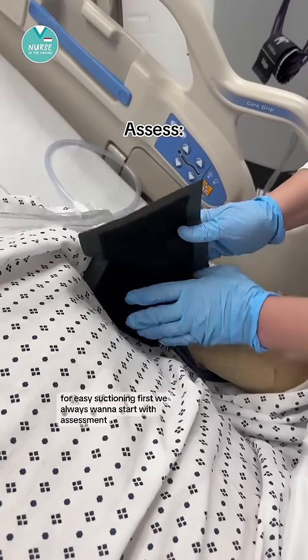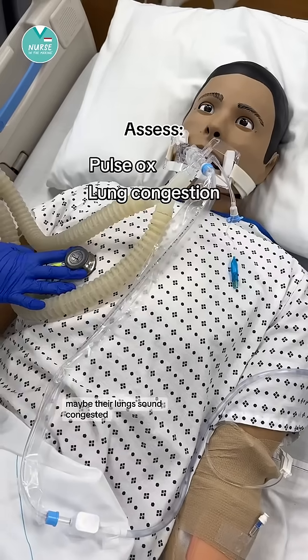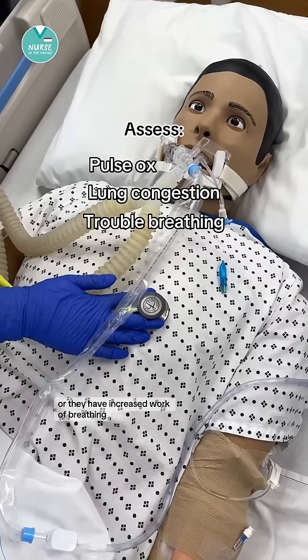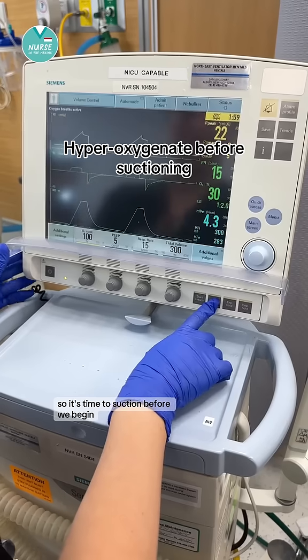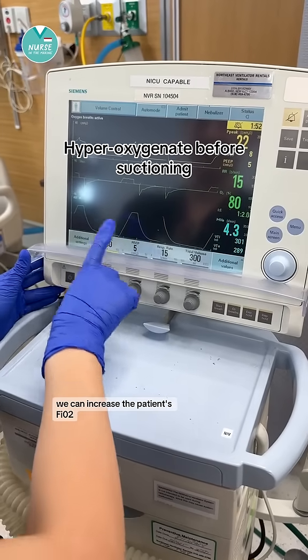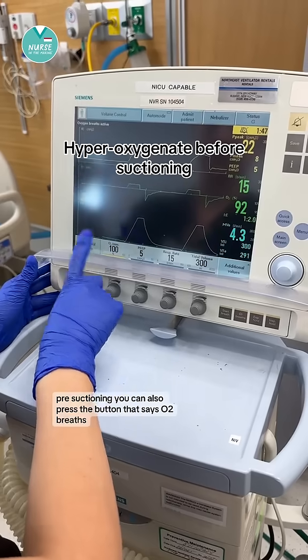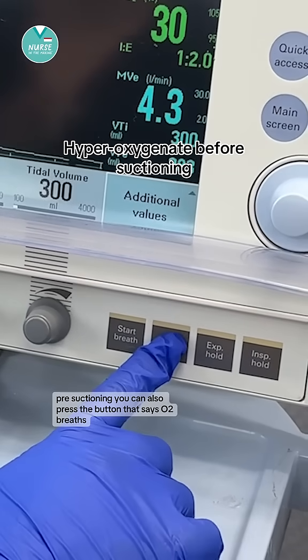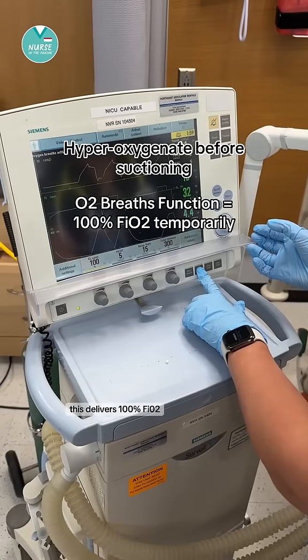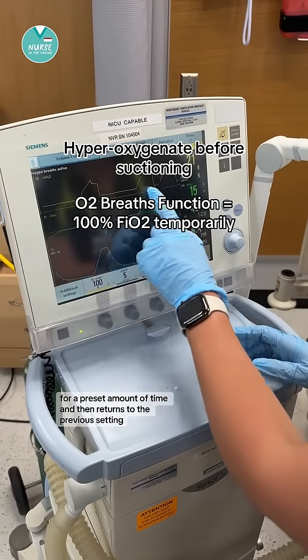First, we always want to start with assessment. We want to make sure the pulse ox is attached. Maybe their lungs sound congested or they have increased work of breathing, so it's time to suction. Before we begin, we can increase the patient's FiO2 or oxygen percentage briefly to hyperoxygenate pre-suctioning. You can also press the button that says O2 breaths, which delivers 100% FiO2 for a preset amount of time and then returns to the previous setting.